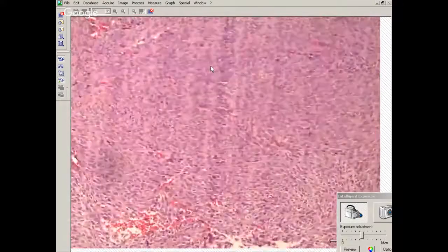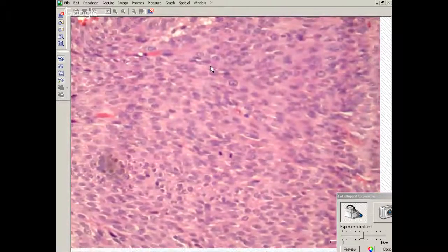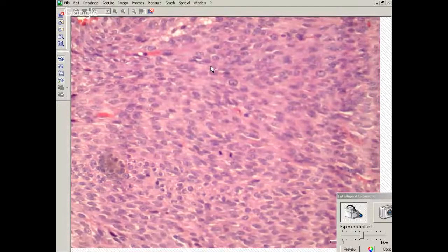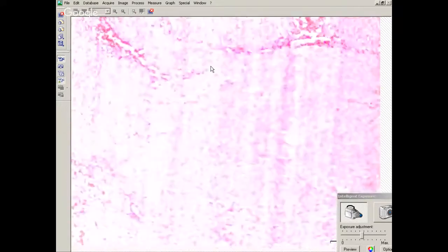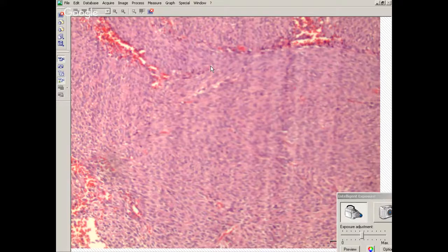This is dural based. There are a few mitotic figures. I think this was the third resection. On the second resection, there were no mitotic figures, and the time interval from the second resection to the third resection was about 10 years. And this was positive for HMB45 and Melan-A. Wow. This is a melanocytoma. It started out being a melanocytoma. In this resection, it's a melanocytoma with atypical features, and it's concerning for transformation into a melanoma.